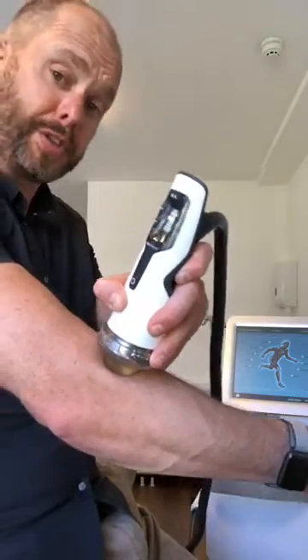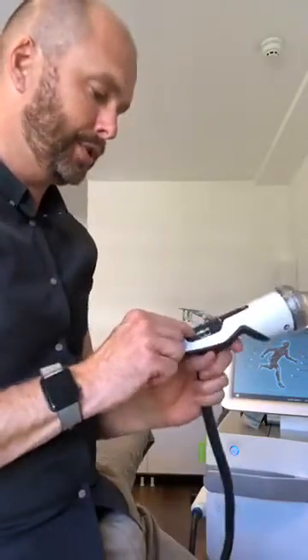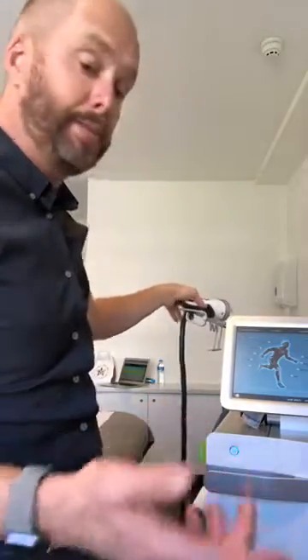When it's on my arm, a slight change in position means we're off our mark — it's got to be straight down on it. We can't lose concentration and start to move because we'll lose the point. So once you're on there, you've got to get constant client feedback to make sure you're not moving your hand over the course of the treatment. Because we're just on 4 hertz, 2,000 shocks will take far longer — probably in excess of double the time compared to using 10 hertz on the radial machine.